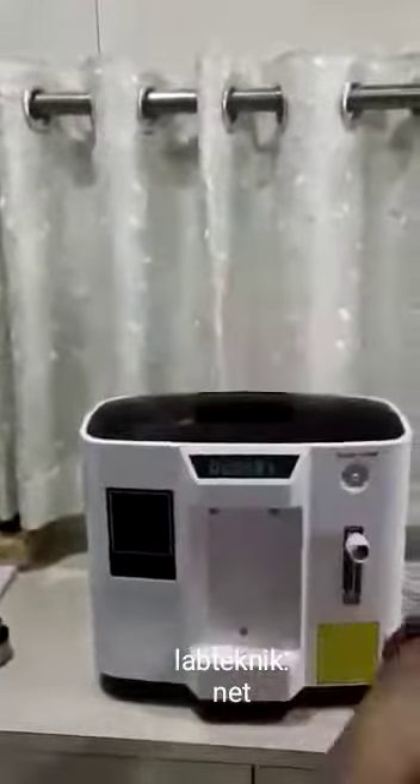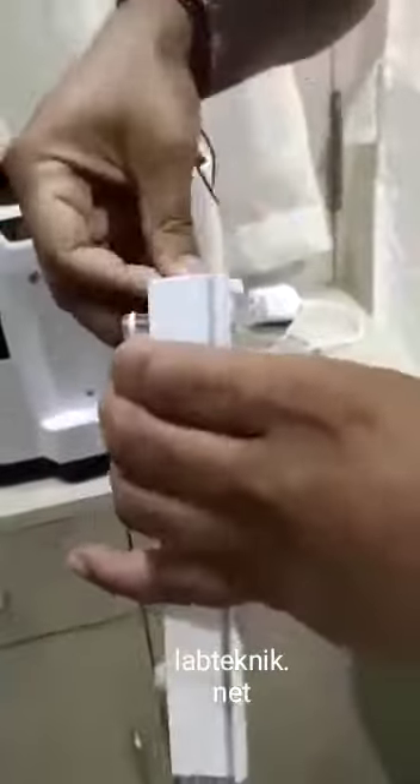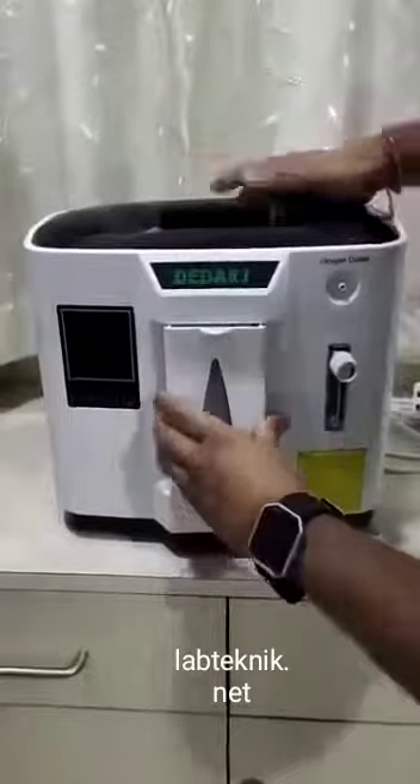First fill it from here. And after filling, put it back on the machine.